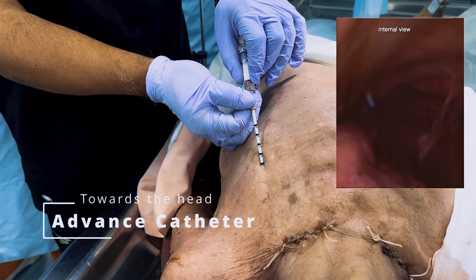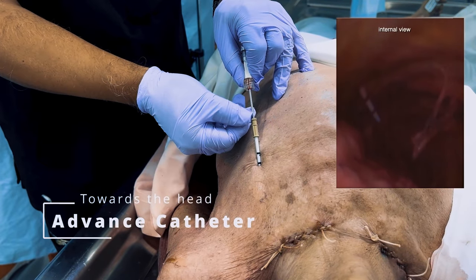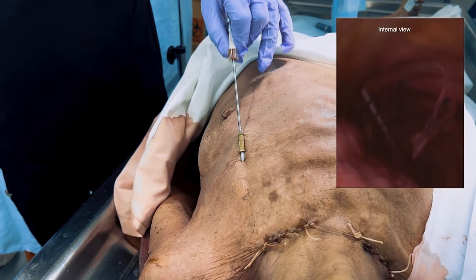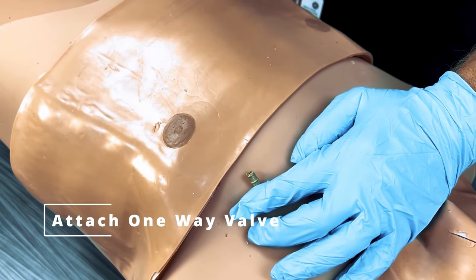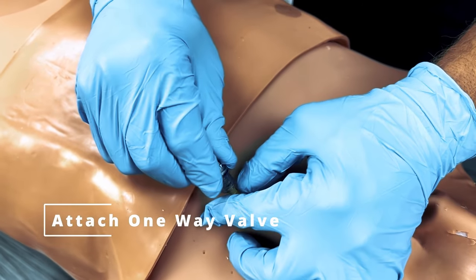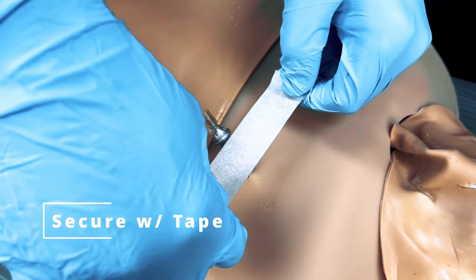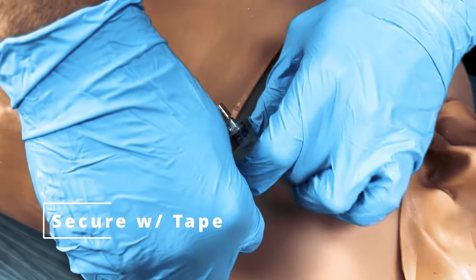Guide the catheter cranially toward the head and advance it over the needle without further advancing the needle itself. Remove the needle. Attach the one-way valve to the hub of the catheter. Secure the assembly to the chest wall using tape.